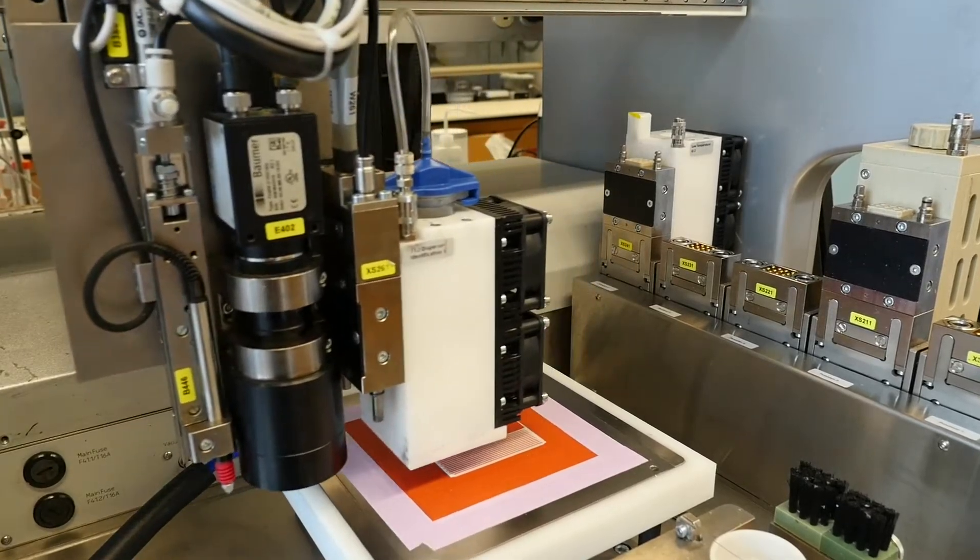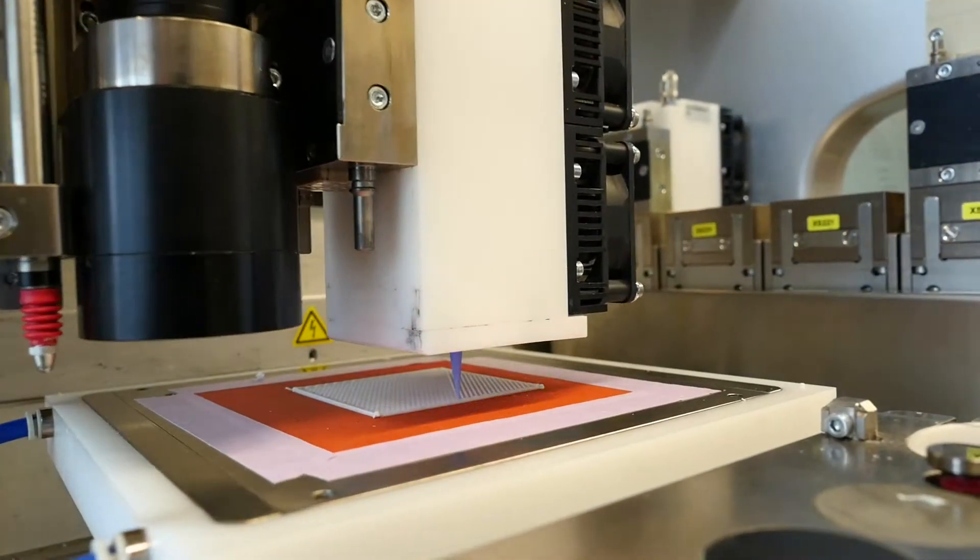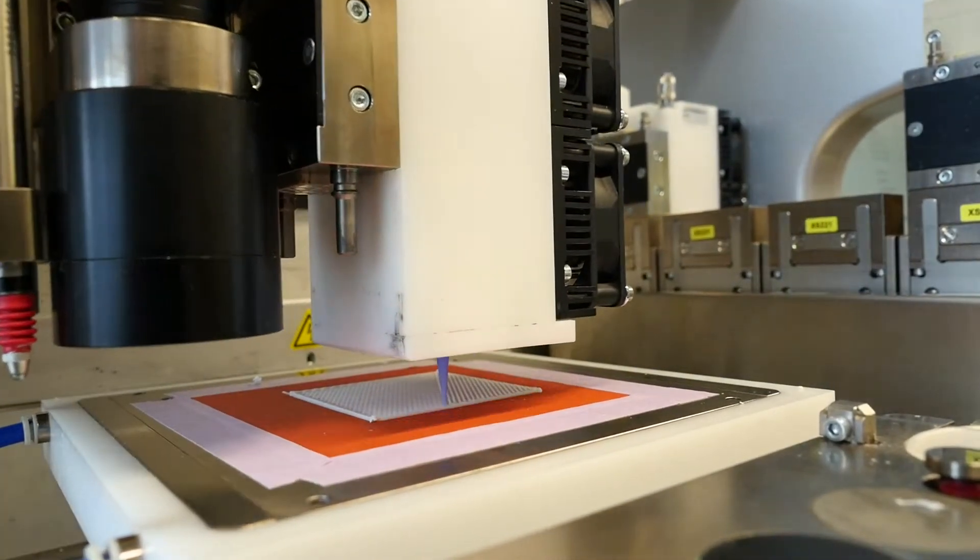What 3D printing allows us to do is to make patient-specific or patient-matched implants. If a patient comes in with a defect — say a craniofacial defect — we're able to take a scan of that defect and print it into the right size and shape that fits that patient perfectly.